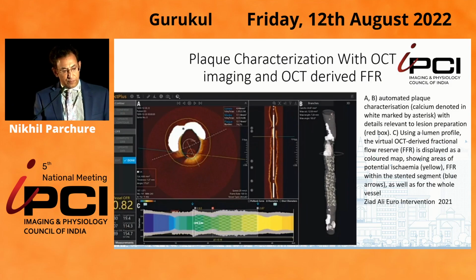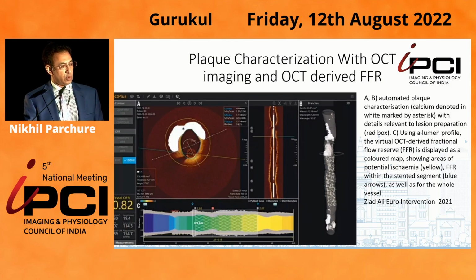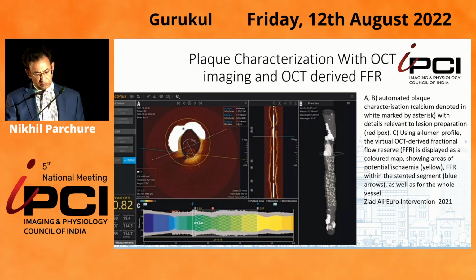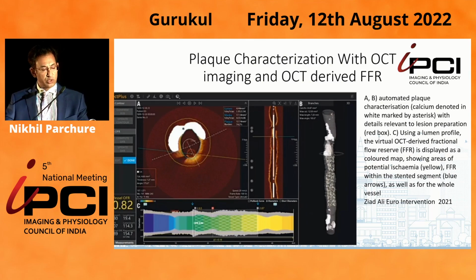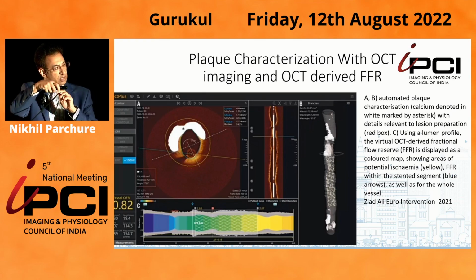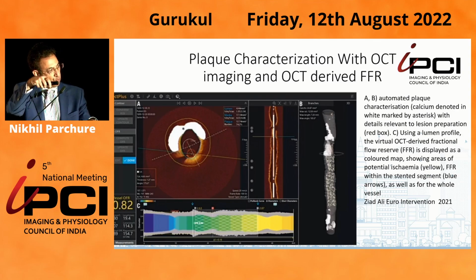This is a slide from Dr. Ziad Ali's wonderful publication in EuroIntervention, the state of the art, which tells about plaque characterization with OCT imaging and OCT-derived FFR. It tells you about automated plaque characterization in terms of calcium. You can see the white calcium with details relevant to lesion preparation. You can see from there, it tells you where you need to prepare and what you need to prepare.